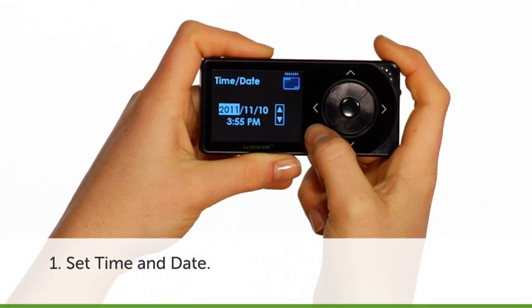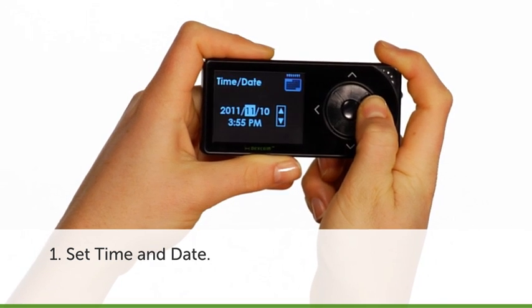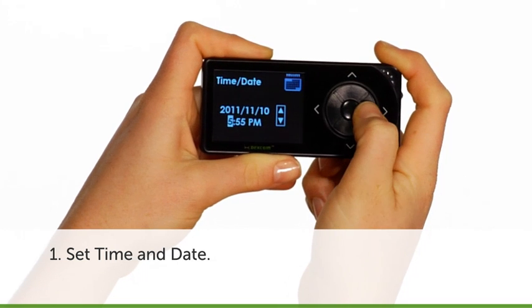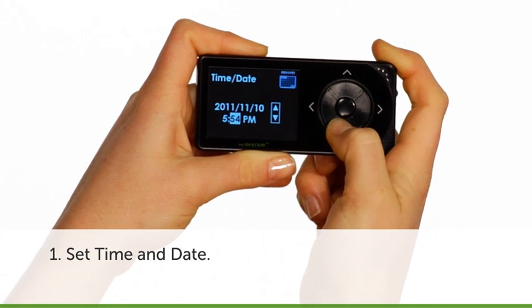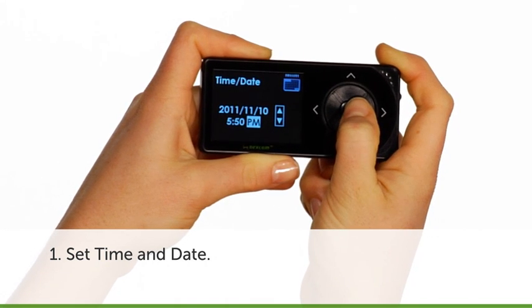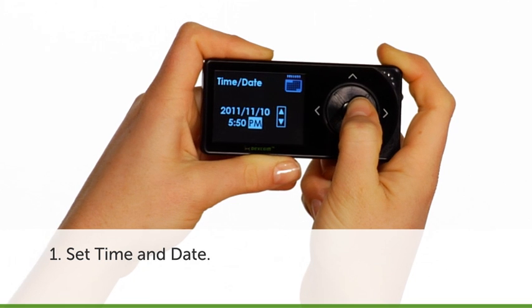First, the time and date. To set the time and date, press the right button to highlight each value and to move to the next value. Press the up-down buttons to adjust each value. After setting the AM/PM value, press the Select button to accept changes and move on to the next step in the Setup Wizard, setting your transmitter ID.